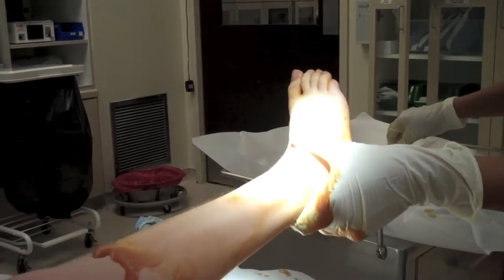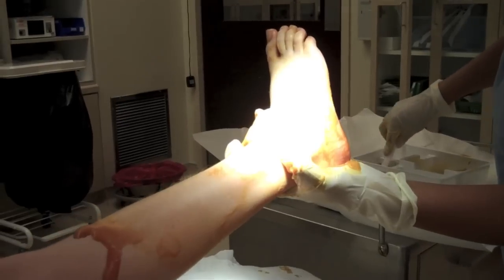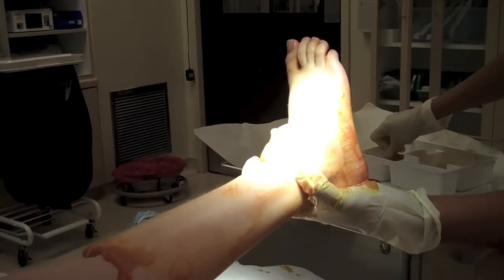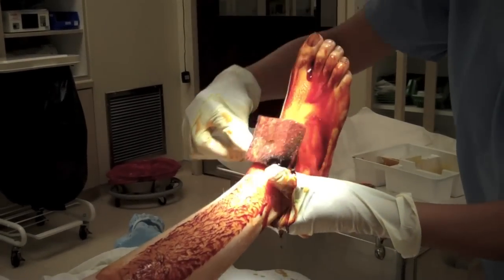I'm taking the sponge sticks and I'm going to do what's called painting. With painting, you can only go one direction — you can't come back and go back over. He's so little, it goes all over his whole foot.